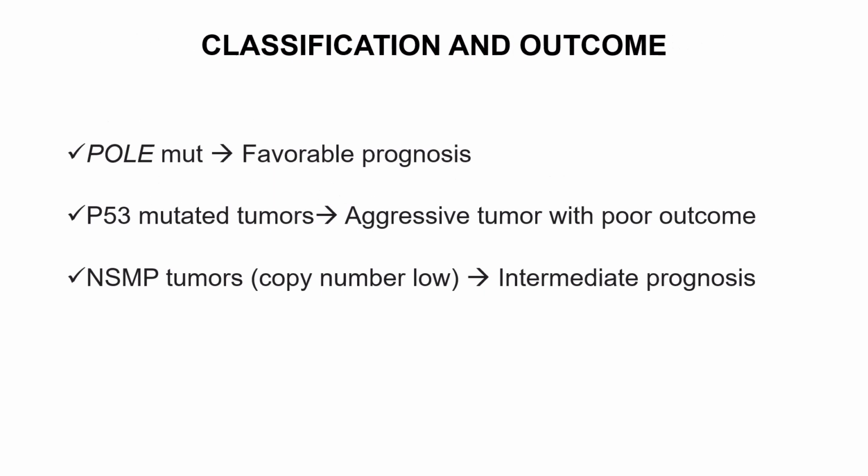The mutation analysis contributes significantly to the molecular classification of endometrial cancer that enhances diagnostic accuracy, guides treatment decision, and predicts patient outcome.